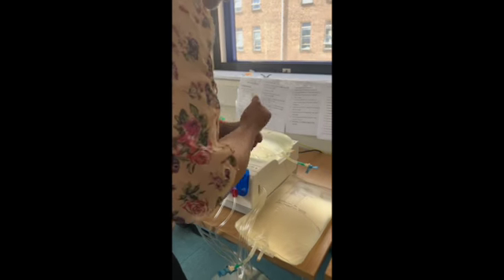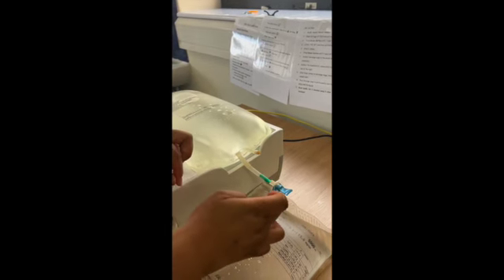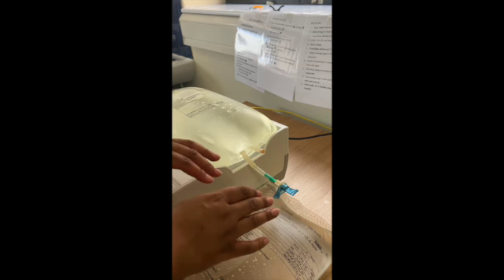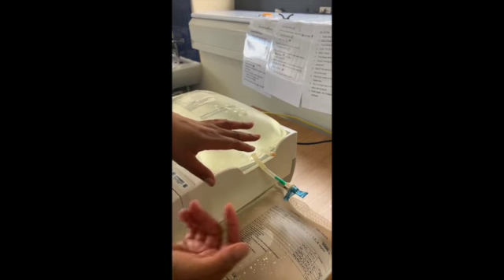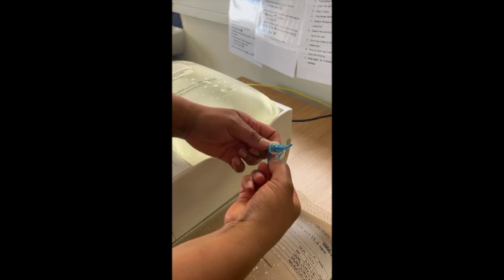Now, it's really important that when I pull the covering off this, that I don't touch any part of what's inside of here, because that puts you at risk for infection. And if that becomes contaminated, then I've got to take all of this off and start the process all over again. So it's really important to keep away from all what's inside of here. So holding the edge and making sure that I don't touch the inside, I'm pulling the cover off.